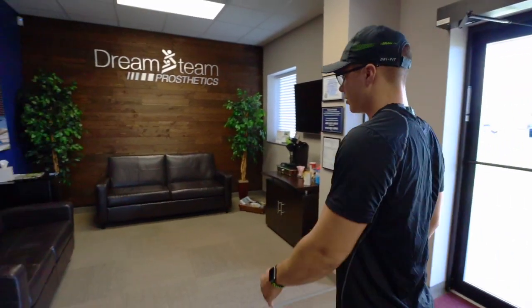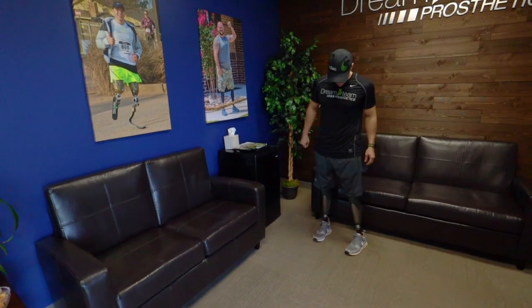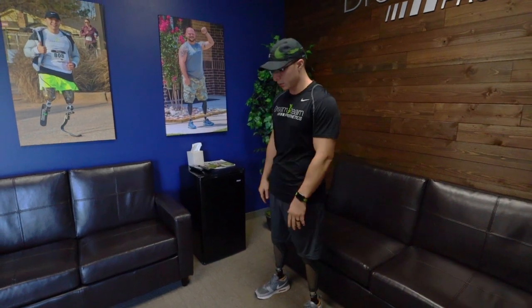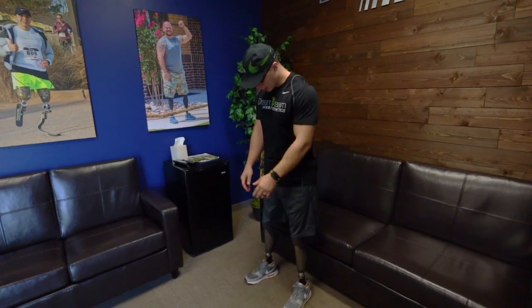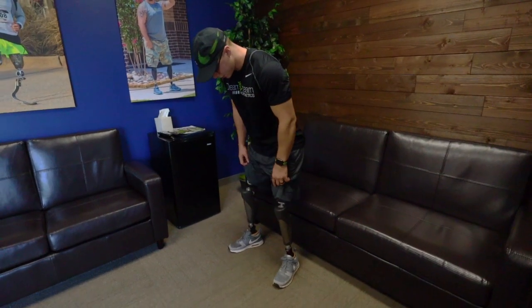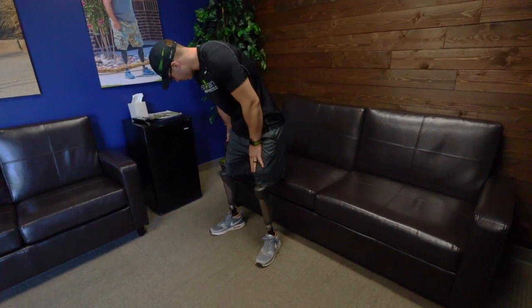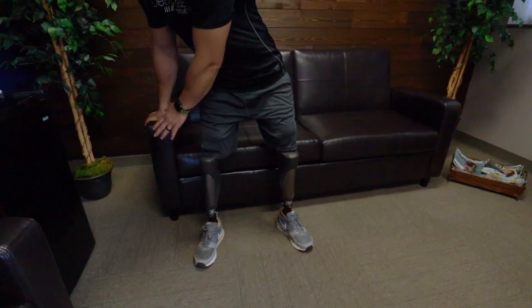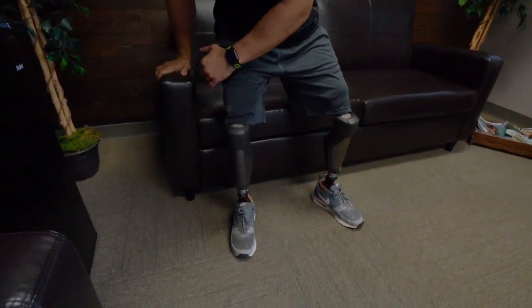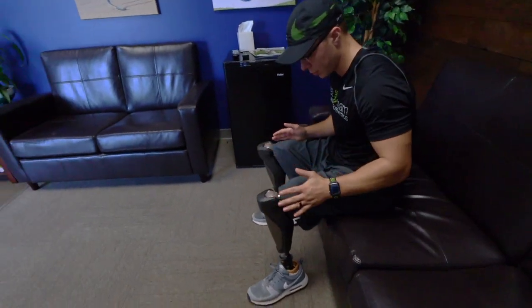Over here featured is a nice little chair. Typically what I tell people whenever they're sitting down in some microprocessor knees such as C-Leg 4, you want to get a shoulder-width stance with the knees and from there you're going to more or less utilize the knee and its ability to bend, and you're going to put your butt back and you can use a hand on the armrest.